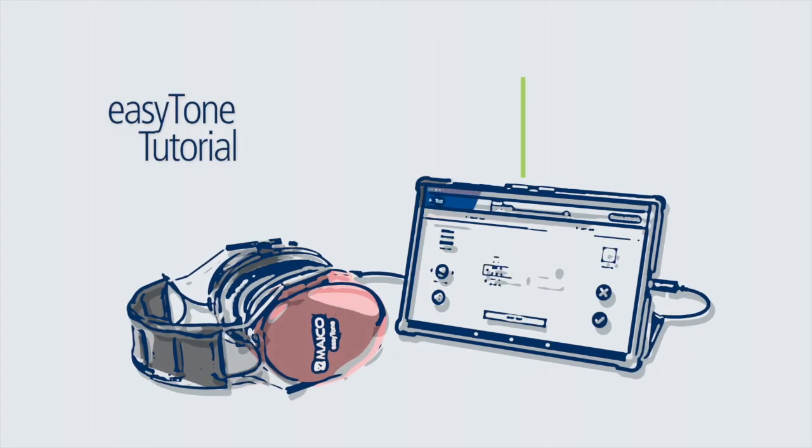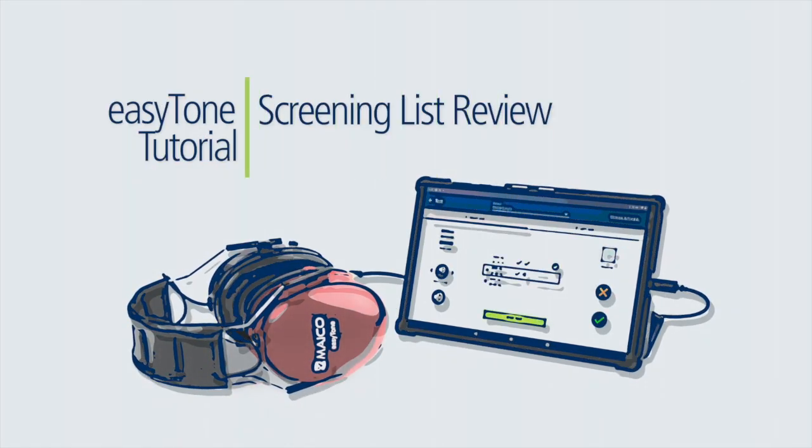This completes the tutorial on screening list operation. Please continue through the tutorial series for additional easyTone instruction.